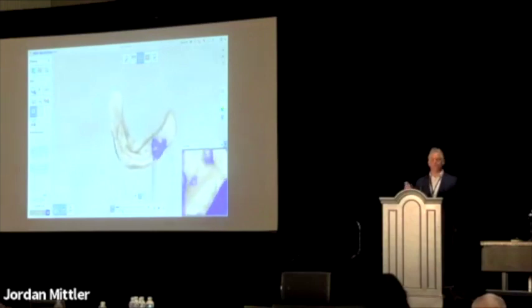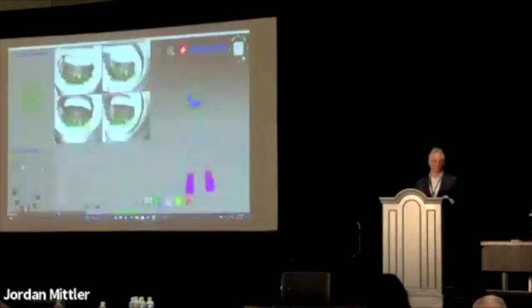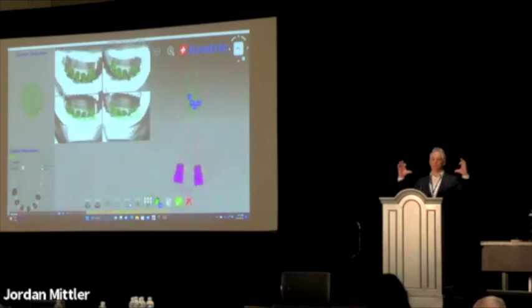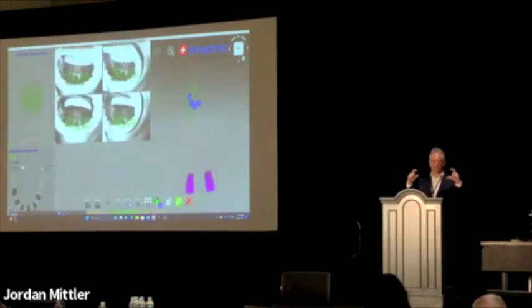Okay, so intraoral scanning we've tried is a completely different technology. It's a key point. Can people do it with intraoral scanning? Yes. Do people have success with intraoral scanning? Yes, you can. The problem is it is technique sensitive. Okay, meaning you have to know what you're doing, or you have to go through and get special training, or you have to learn through trial and error yourself. It's not just a 100% thing that works every time. So all intraoral scanning is taking small images and stitching them together, right? And when it goes across the arch, that's where we're missing the accuracy. Photogrammetry, on the other hand, is taking a picture of the whole thing, and it's taking multiple pictures at different angles. Okay, it's not stitching small photos together.